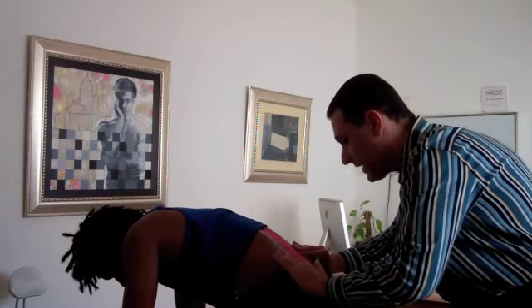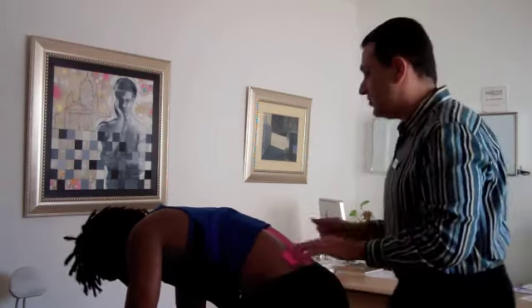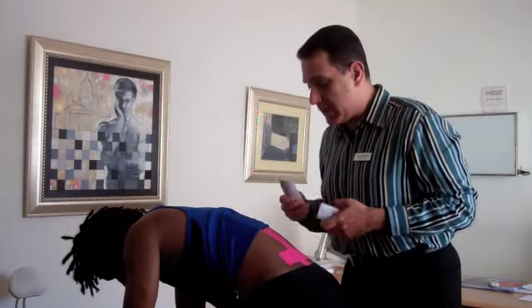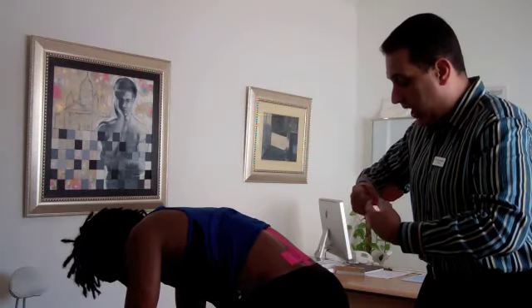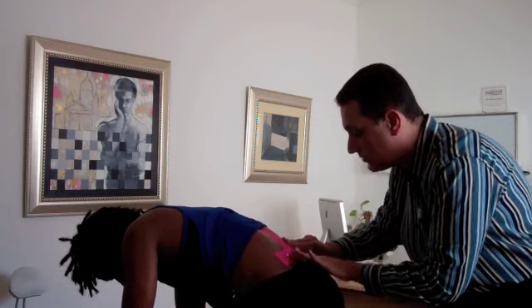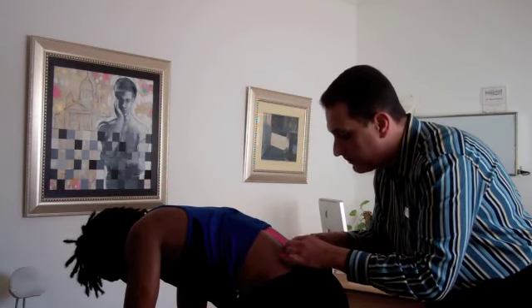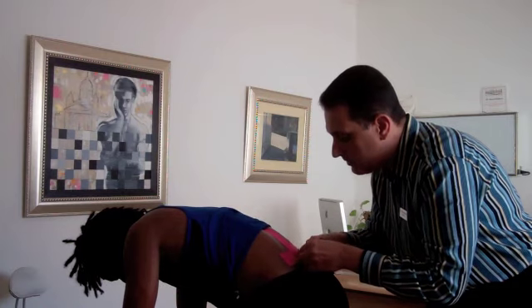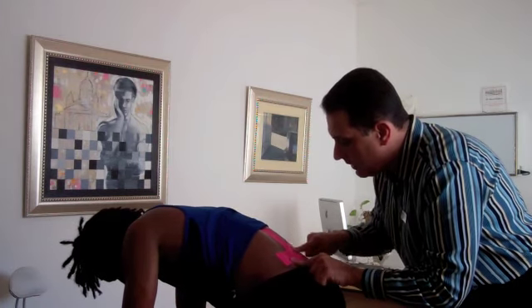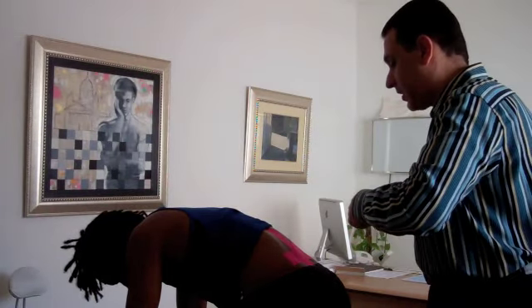Traditionally, if an athlete can't get to rehab consistently due to active training, or whether it be somebody working in an office who sits a lot, this is going to help to support the structures while they're receiving the care that they need to rehabilitate the actual areas of involvement. This taping is an excellent means of support to these soft tissue structures.